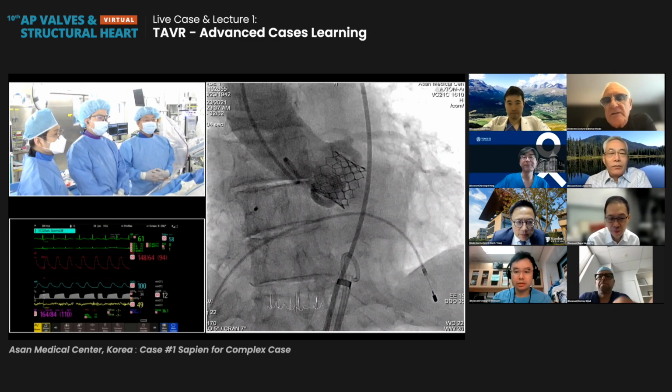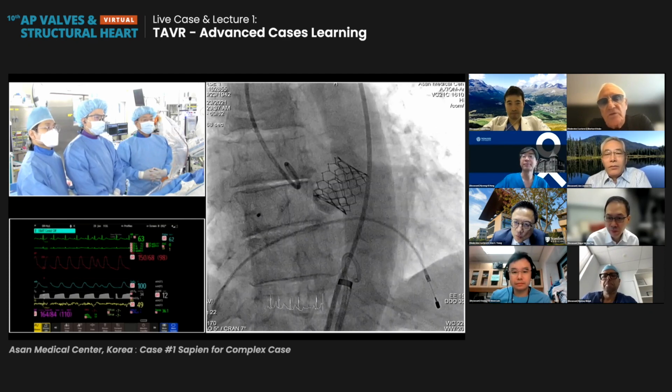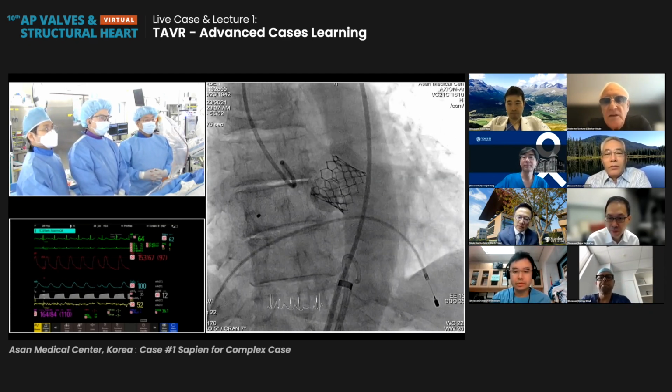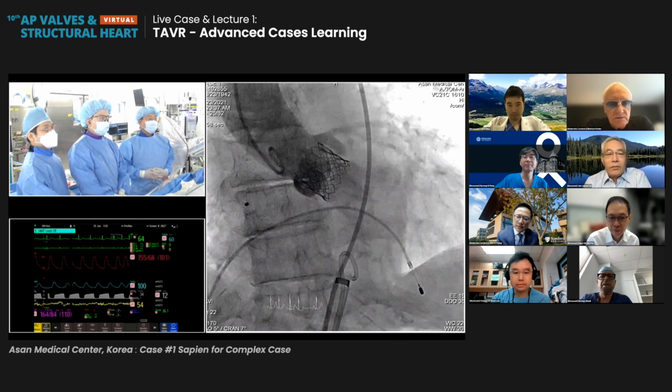No, I think it's very well done, SJ and team. The question still remains whether to do TAVR first and then followed by ASD, or the other way. I think you showed it beautifully and with an excellent result, and the patient is taken care of. I think that's excellent. All right, thank you.